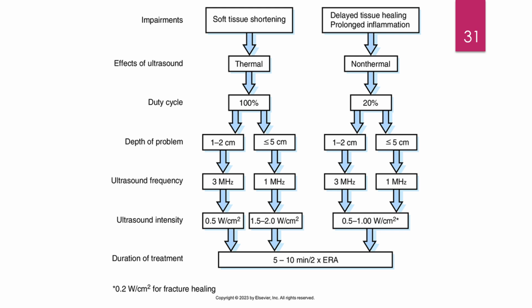Remember absorption. As that sound wave travels through the tissue, those different structures along the way are going to absorb some of that energy, and also think of the attenuation. As that sound wave travels deeper and deeper, it becomes less intense. So in order to counteract that, we need to increase the intensity so that we can actually deliver energy to those deeper tissues.